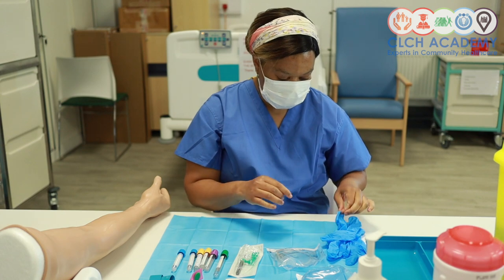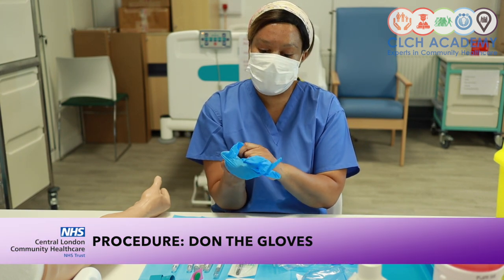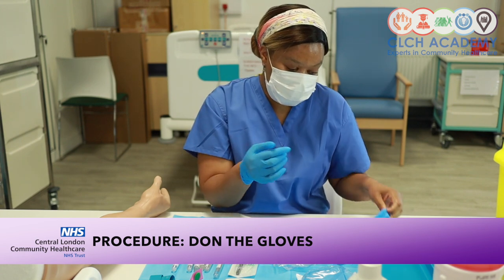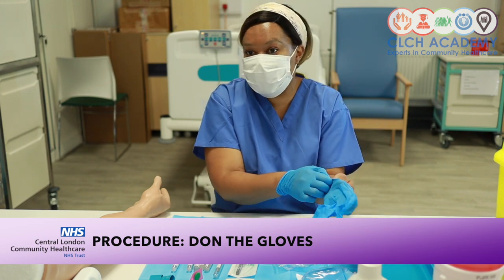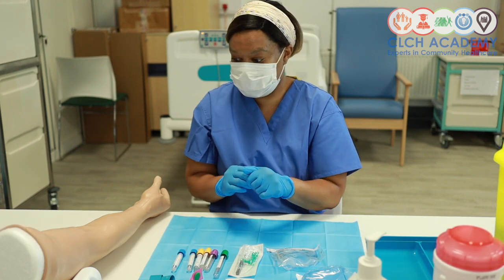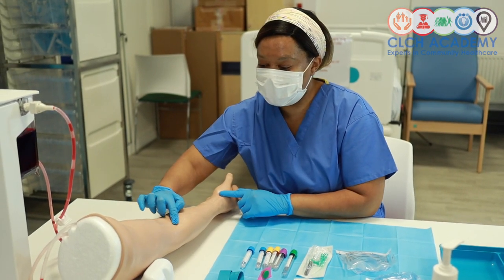Right, I'm now going to put on some gloves as I'm going to come into contact with the patient's skin. Now, some people might advise you that it is better to feel for a vein with skin only. And if that is you, then make that easier. But obviously in COVID times, some people may feel more comfortable if you actually put your gloves on. So I'm going to have a little bit of a feel for the different veins I can access.